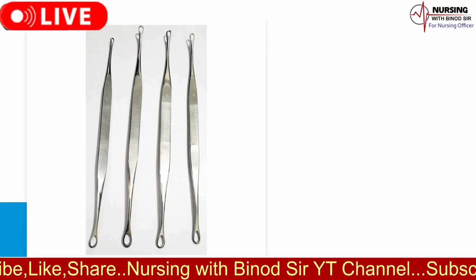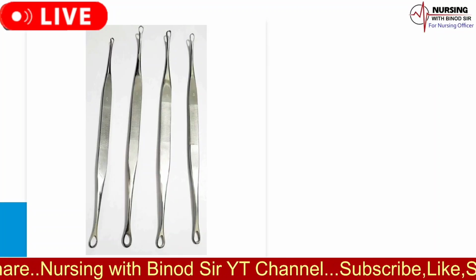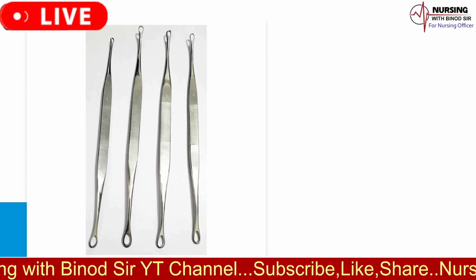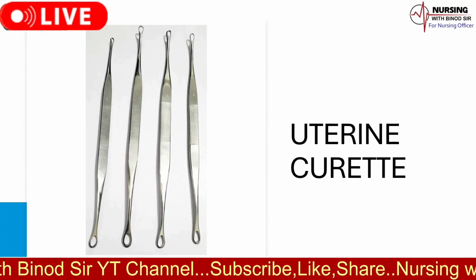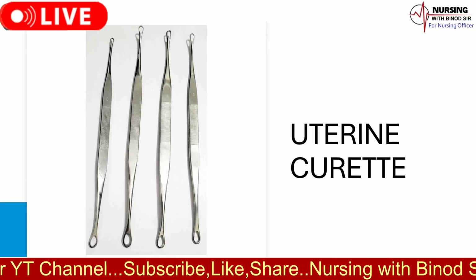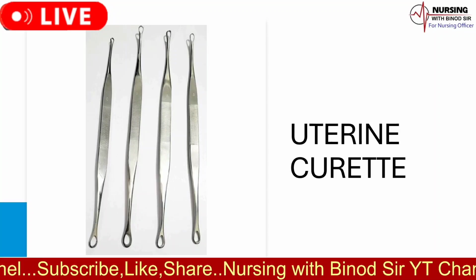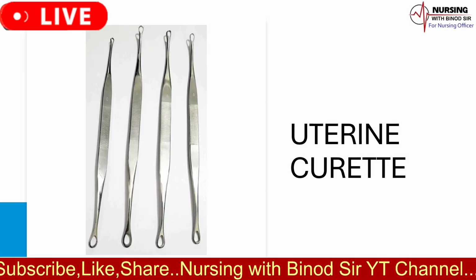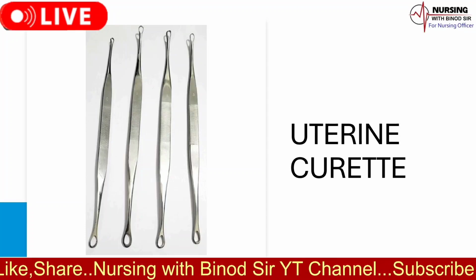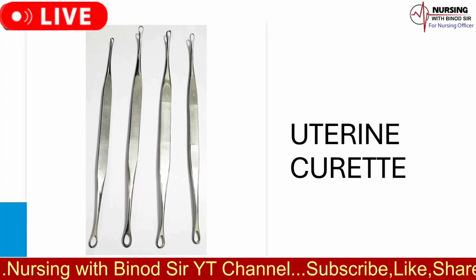2. Endometrial biopsy. It is used to take a sample of the uterine lining to diagnose conditions like endometrial cancer or investigate abnormal uterine bleeding. 3. Uterine polyps removal. The curette helps in removing polyps from the uterine lining, which can cause irregular bleeding or other issues. 4. Management of miscarriage. It helps in removing retained products of conception following a miscarriage.